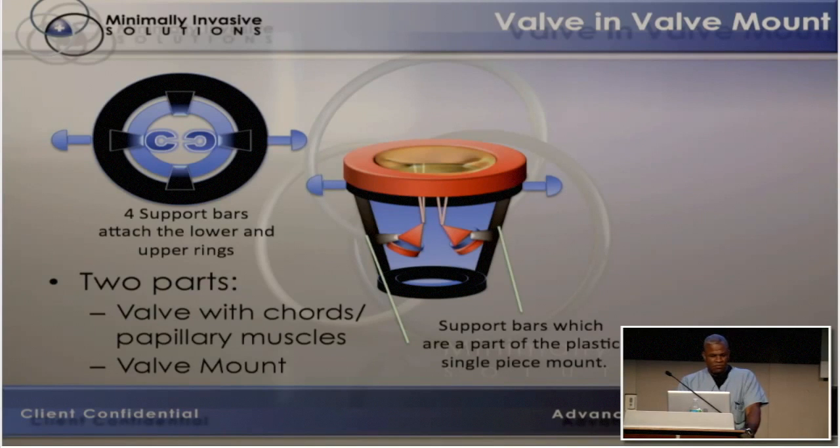We designed a couple, one out of metal and one out of plastic, and we had it with two different companies that were working with us at the time. During this time, I'm doing WebExes with the company in Canada called LifeLike Biotissue. We also have a doctor that's working with us from the UK, which is a time difference as well, and also a surgeon in California. And we were all collaborating. And so over the process of 2 years, this model just continued to get better and better.